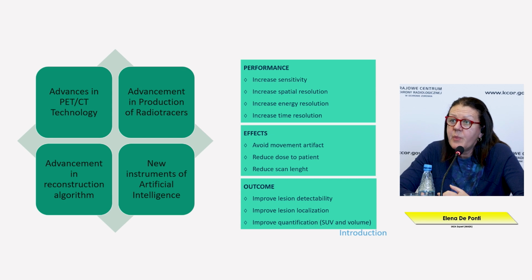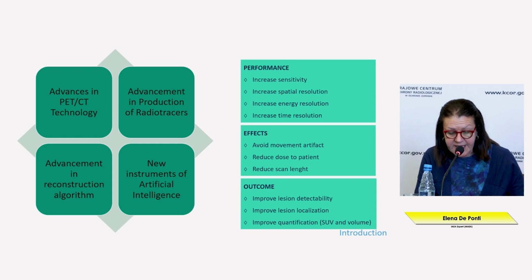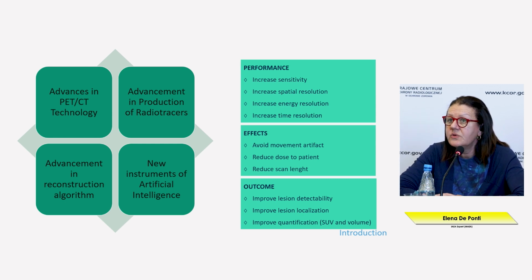That could be an important issue, in particular when we have patients that are going to be scanned many times during their path to get free from a disease, but also to reduce scan length, to be able to perform the scan in a proper way according to the patient positioning.